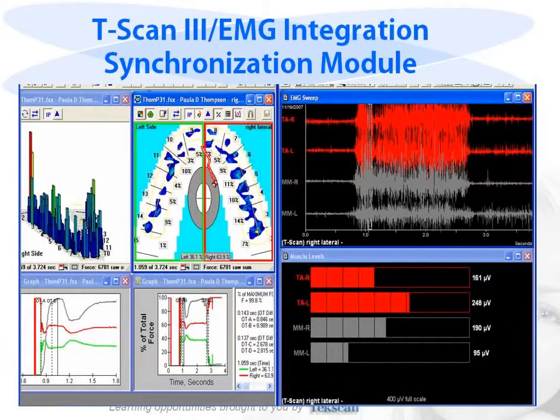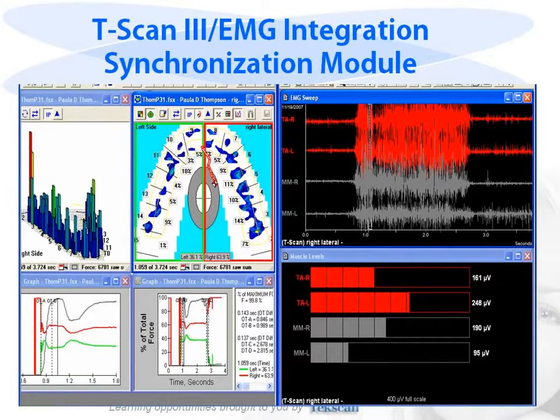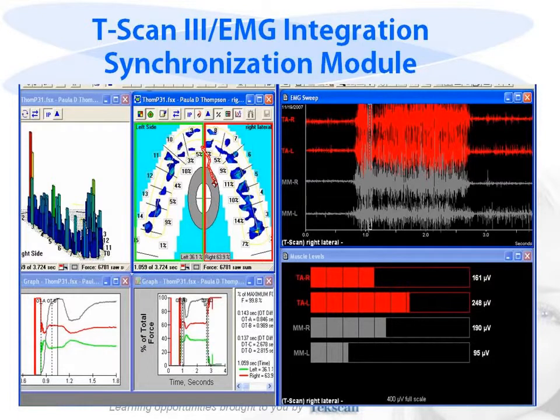The two programs synchronize and integrate occlusal data with muscle activity, allowing for dynamic playback. Together, they give a complete view of your patient's bite.